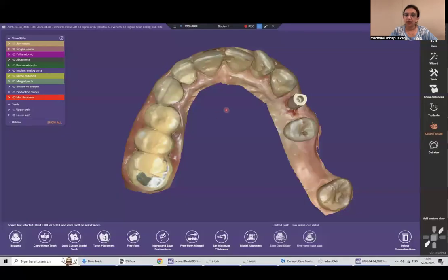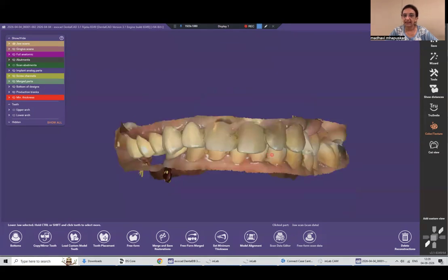Now the first step would involve scanning using the scan body. This scan body can be used for both the conical tie bases, which are used for bridges, as well as the normal tie base, which is used for single unit restorations. So you would scan the upper jaw, the lower jaw, and do a bite scan. In this patient, we are restoring the 2.4, but we are also doing a conventional 3 unit bridge, and we are doing an implant supported bridge in the lower posterior region.